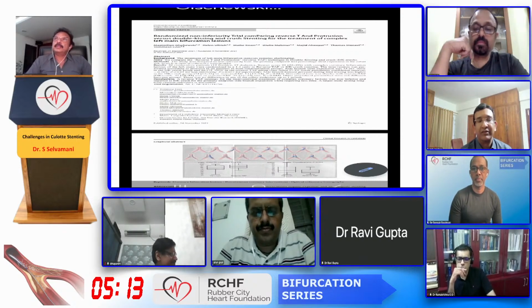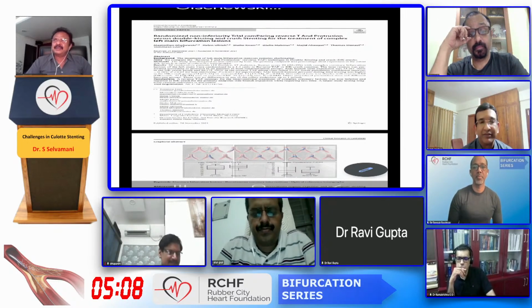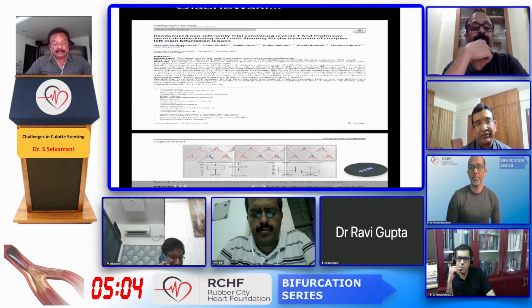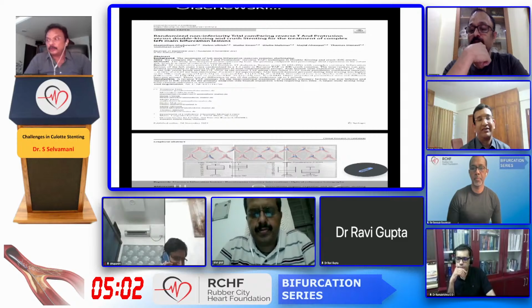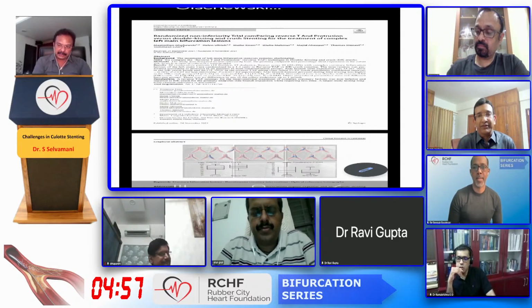So where you can put a bigger balloon, dilate, and then, because here in this case, there was a dissection and almost very critical narrowing in the left LCX ostium. I did not want to lose that circumflex. Scared of you. It was a flowing vessel.